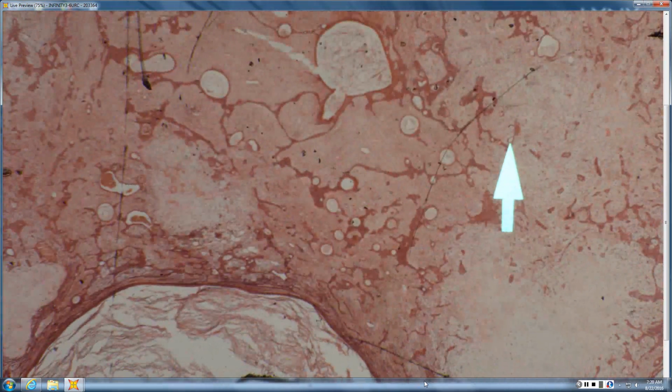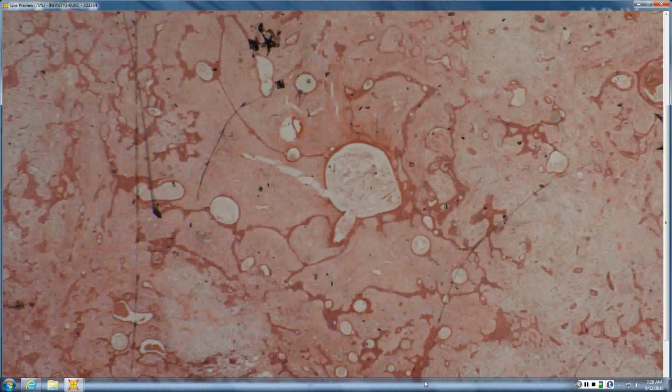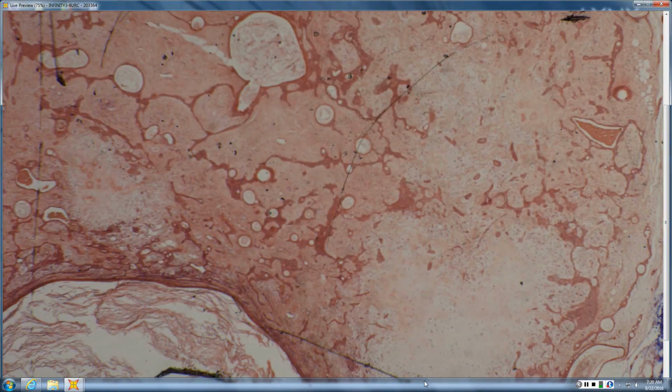Okay. So this is kind of getting into one of the last entities. This is another mixed tumor, branching alveolar type. And this one is a little bit harder because it's so pink. The slide has lost some of that bluish hue. And since we've done this multiple times, I'll just kind of quickly pass this one. But this area would have normally in a fresh cut slide, hopefully, been a much more bluish, kind of classic cartilaginous appearance, and then you get the branching alveolar pattern here. So without that blueness, it can be a little bit challenging.